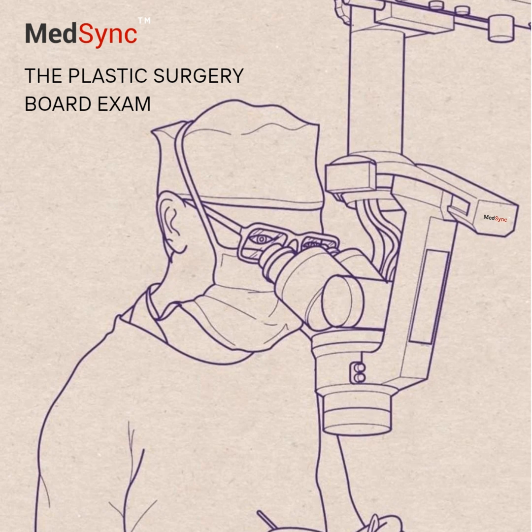Okay. What about just using simple gauze? Gauze is an option. It's often easier to conform to complex wound shapes, no shape memory. Some argue it might be less painful on removal compared to foam, where tissue can ingrow. Any others? Honeycomb textiles? They exist, yes. Another interface option, but maybe less commonly used or studied compared to foam and gauze.